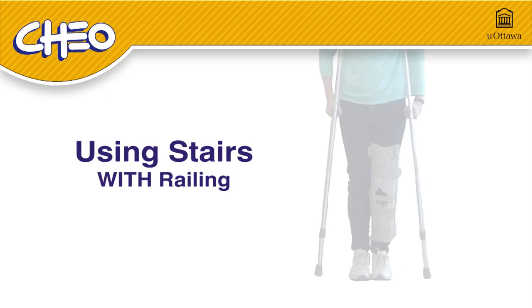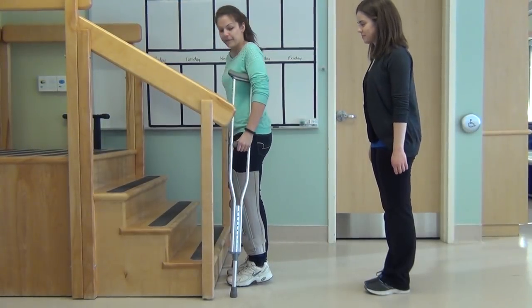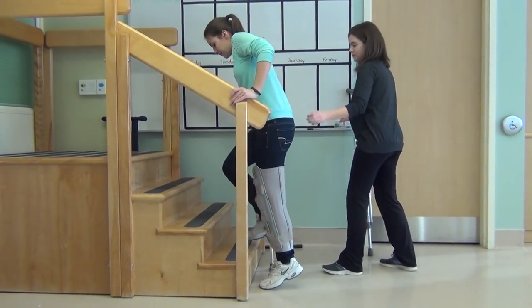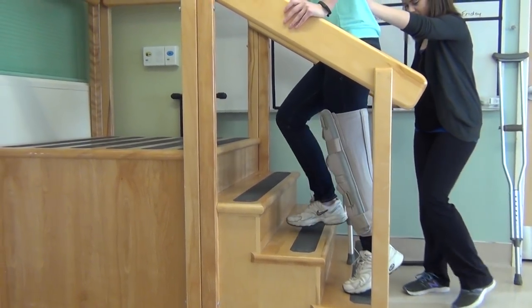Using the stairs with railing. Try to limit the amount of times you have to use the stairs throughout the day. It is always safest to use a railing if possible. An adult should be there to make sure the child can safely climb the stairs. Hold your crutch in one hand and the railing in the other hand. Have an adult carry your other crutch.